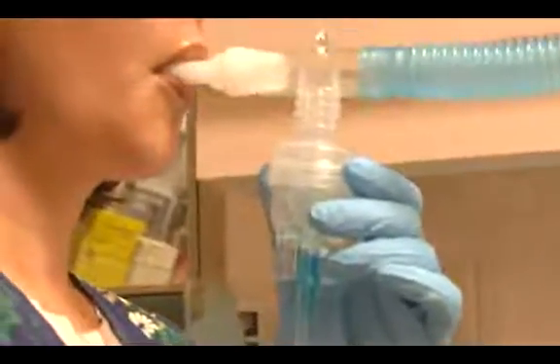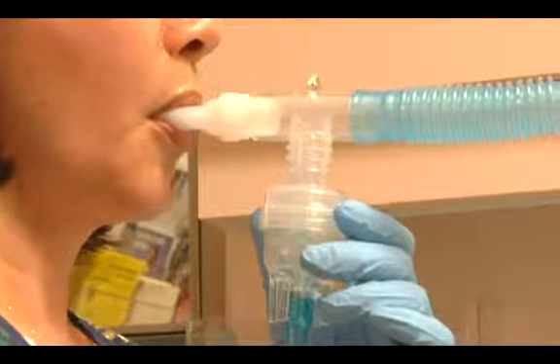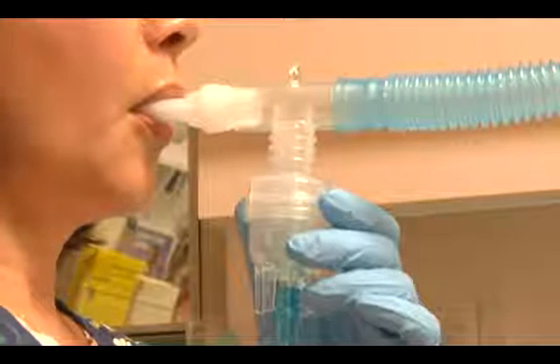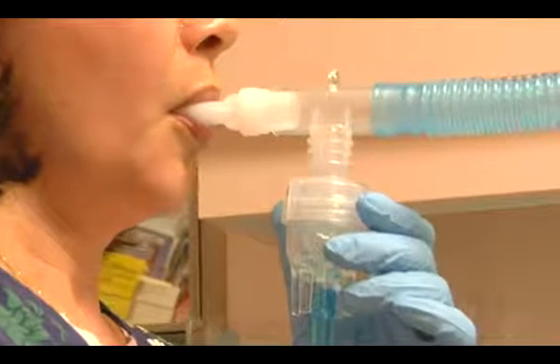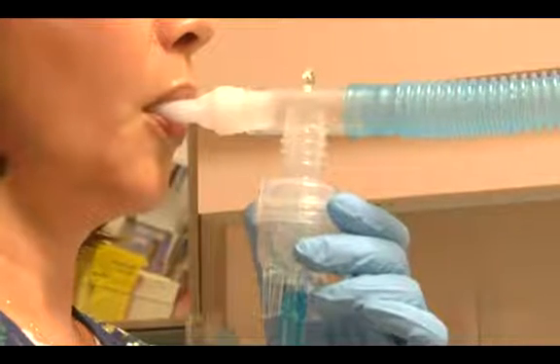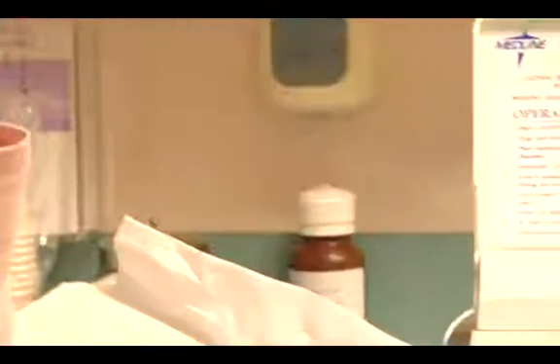And we're going to put it directly in our mouth and then take slow, deep breaths. And then every couple of breaths, we really try to hold it down. The biggest problem with the nebulizers is that sometimes patients will be trying to inhale it too rapidly. So we always want to slow the patients down and take just slow, deep breaths.